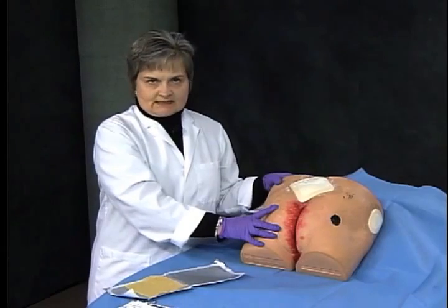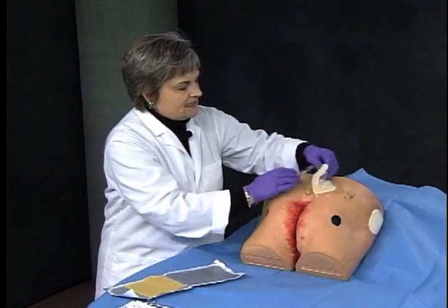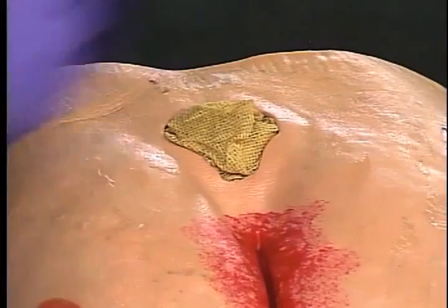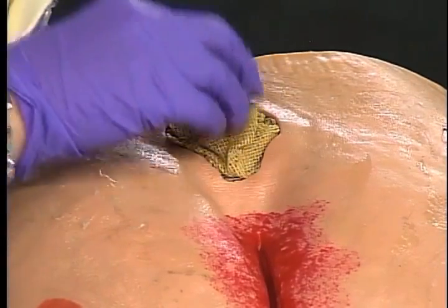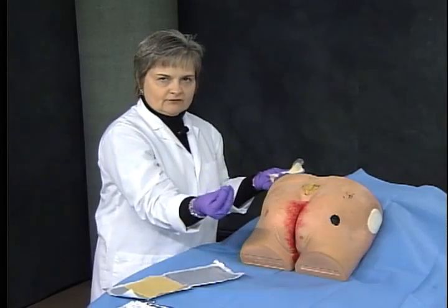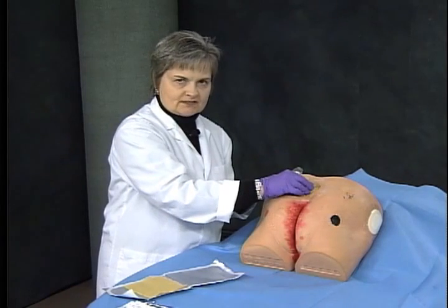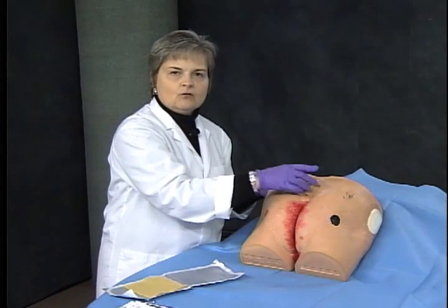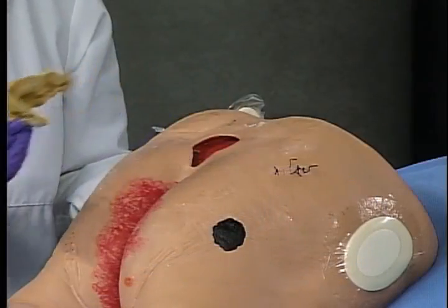Now, removing the dressing, you're going to, first of all, want to remove your cover dressing, gently removing that from the skin. If the dressing is still moist, which it should be because the dressing must be moist for the silver to be effective, you're just going to gently lift it out of the wound. If the dressing has dried and is adherent to the wound surface, what you want to do is just saturate the dressing with sterile saline or sterile water and allow that dressing to soften up a little bit, and then just gently pull it up and out of the wound and discard it.